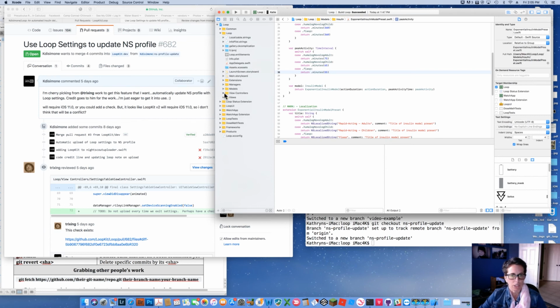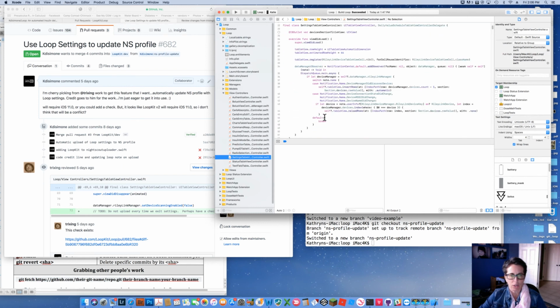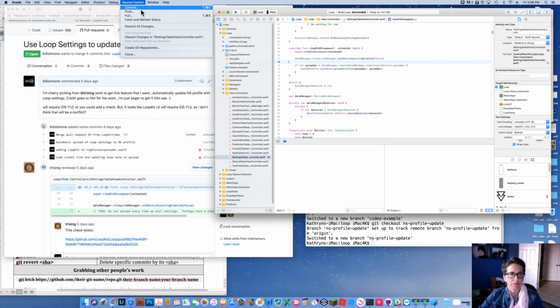View controllers, settings table view controller, line 72. And he's saying this note can be taken out because it does check. So I can check that out. And I can save, let's commit this change.